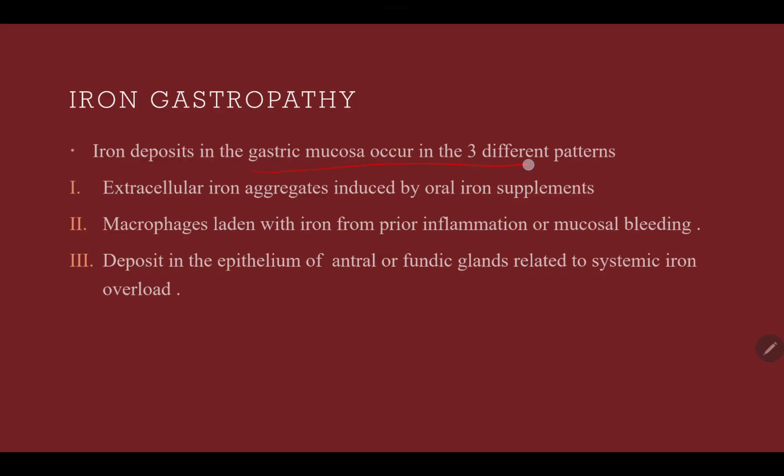So this is iron deposit. A patient who is on iron therapy. Extracellular iron aggregates are induced by oral iron supplementation. So oral iron supplements, which the patient is having for a long term, result in extracellular iron aggregates. Then macrophages laden with iron from prior inflammation or mucosal bleeding.